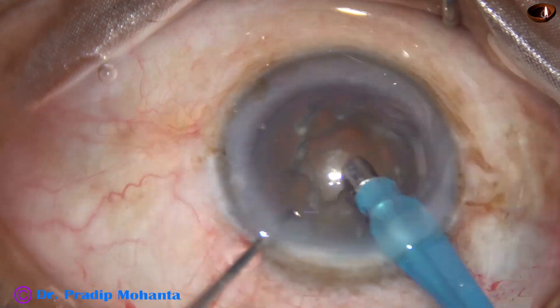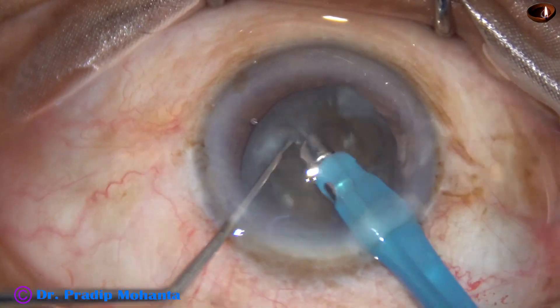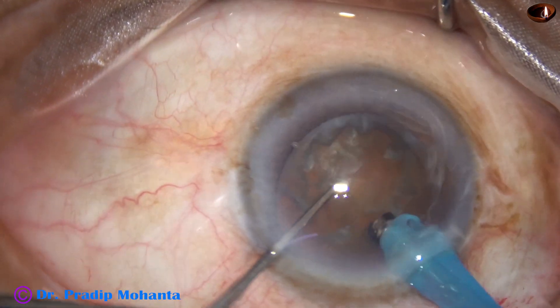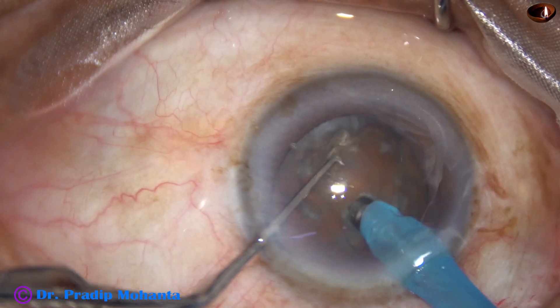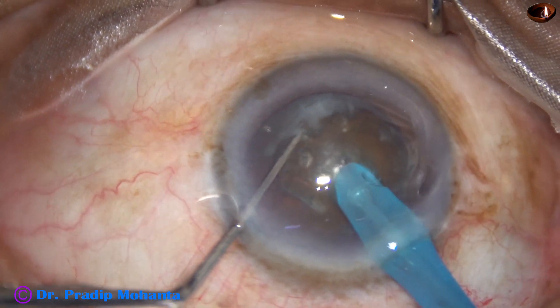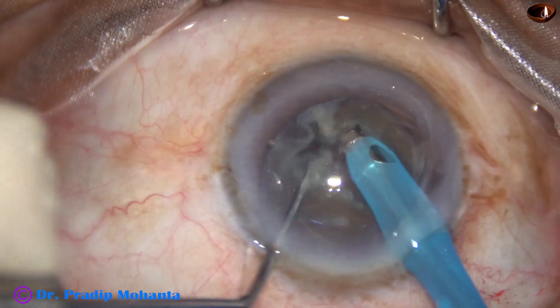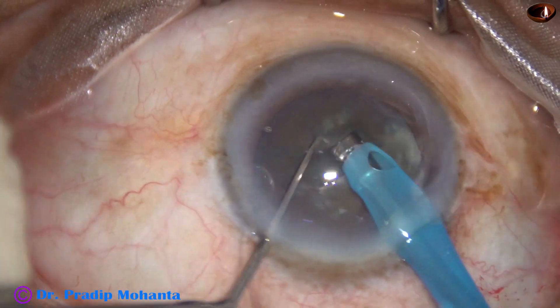The phaco needle goes in beveled down. Some superficial cortical lens matter is removed and now watch submarine chop. The phaco needle travels through the substance of the nucleus and a nice crack is achieved.